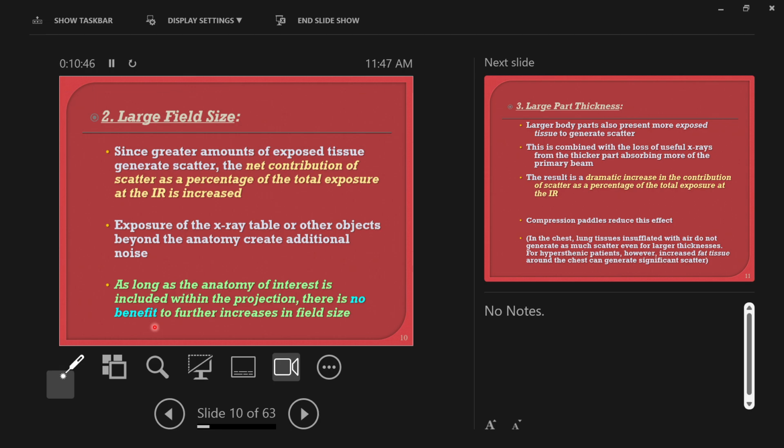Like here, there's almost a 1/2 inch misalignment, which is obviously within the spec, but everyone's going to have a little bit, and it can be more or less dialed in. It just can never be more than those numbers. Or else, what's the point of even having a collimator light if it's not showing you where your radiation field is?